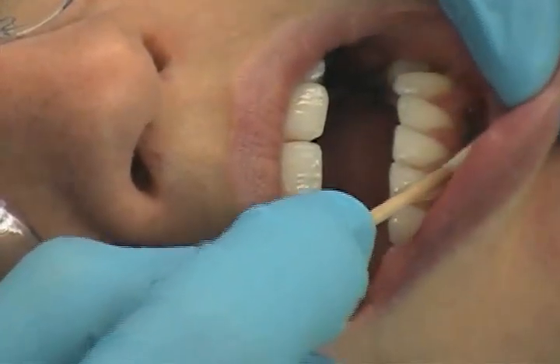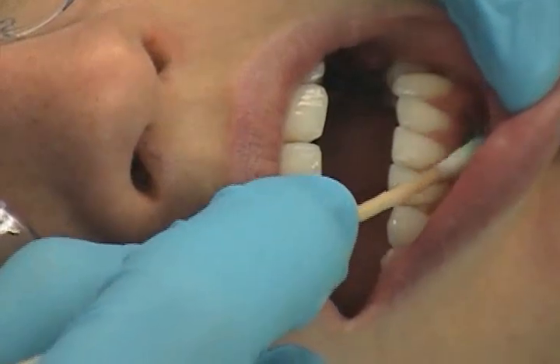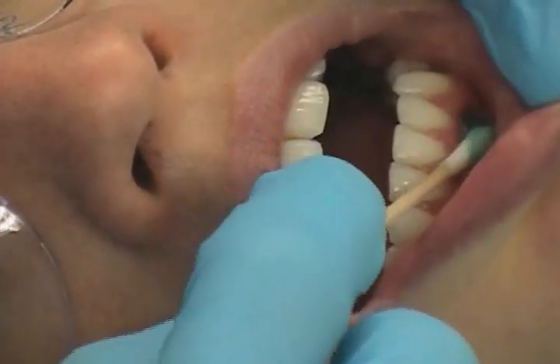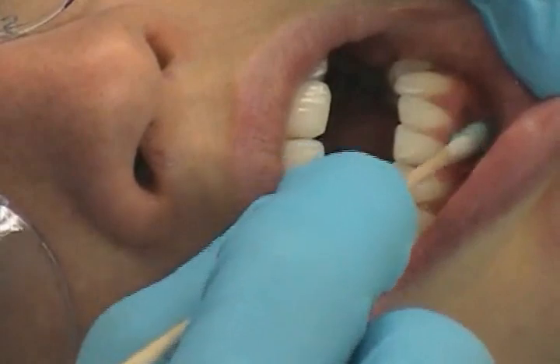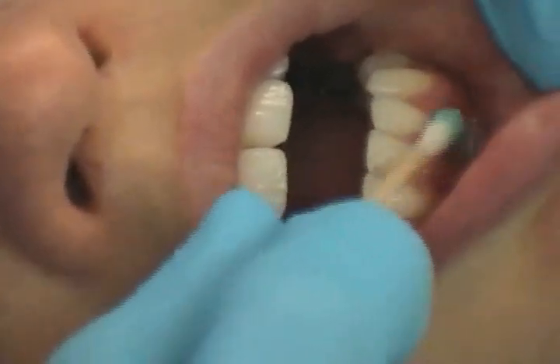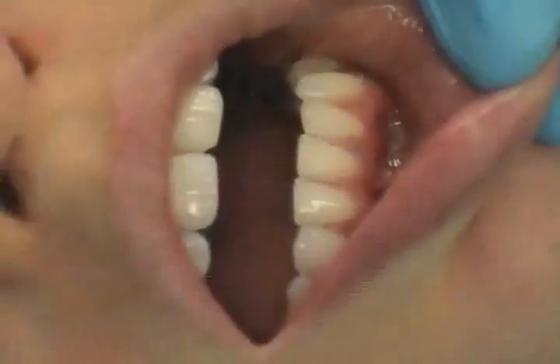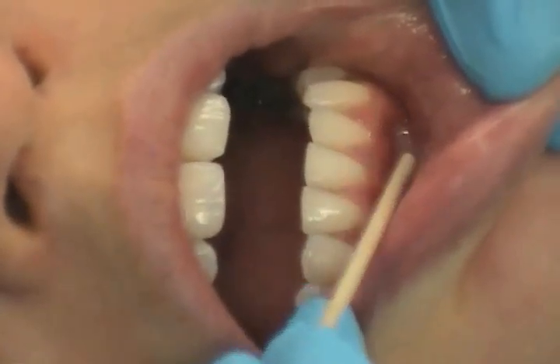The patient position is going to be supine. The operator position is going to depend on the area. The landmarks for the maxillary and mandibular is the mucobuccal fold parallel to the root, close to the bone and apex over the tooth.